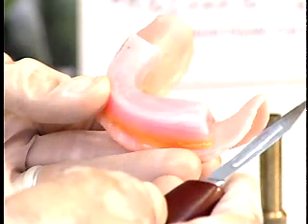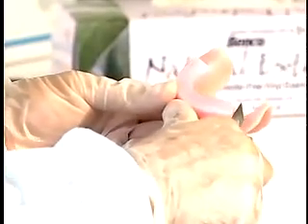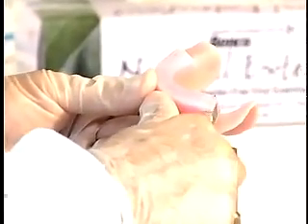Practice guiding your patient into centric relation with the record bases in the patient's mouth. You must hold the mandibular record base in position with your hands when making a centric relation record for complete denture patients, as the mandibular record base can lift away from the patient tissues, invalidating your records. Remove a strip of posterior occlusion rim approximately 1 mm in depth from the mandibular occlusion rim on both sides posterior to the canine lines.